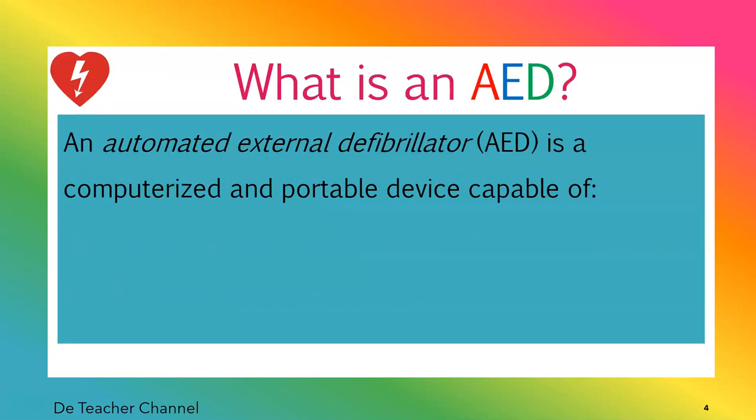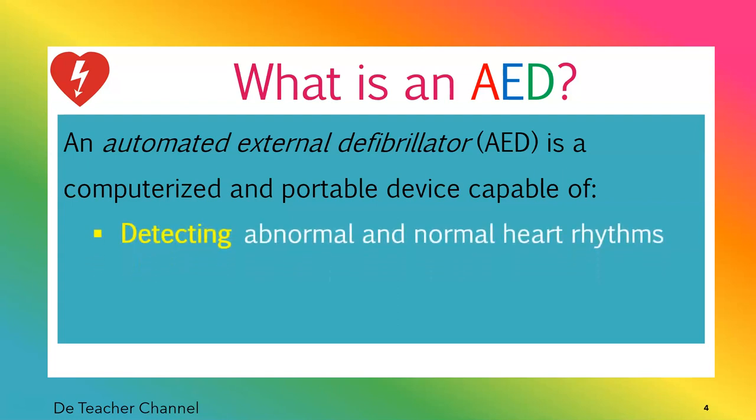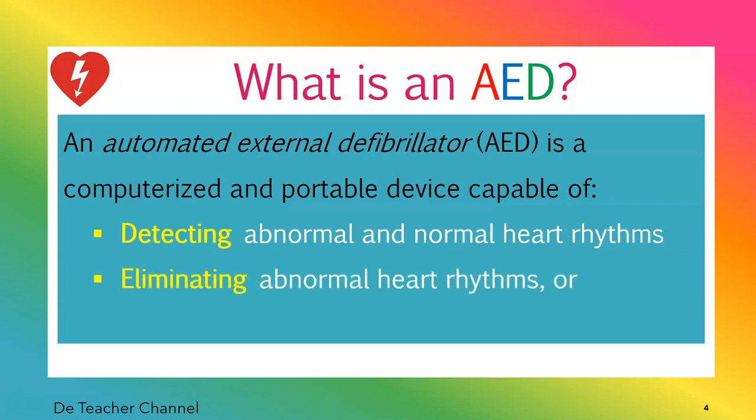What is an AED? An automated external defibrillator, AED for short, is a computerized and portable device capable of detecting, very important, detecting abnormal and also normal heart rhythms, eliminating abnormal heart rhythms, or restoring normal heart rhythms.